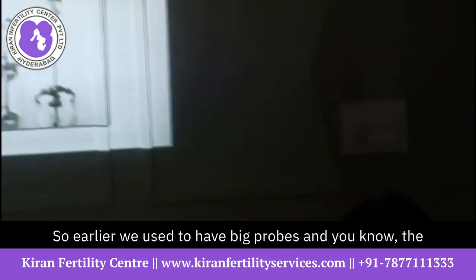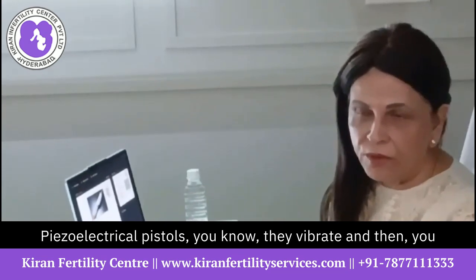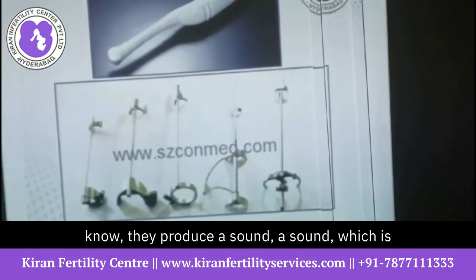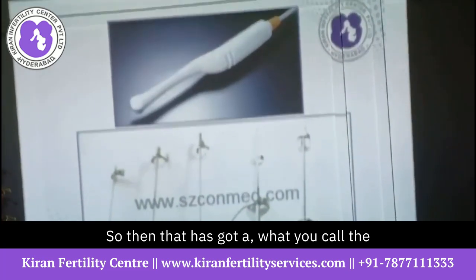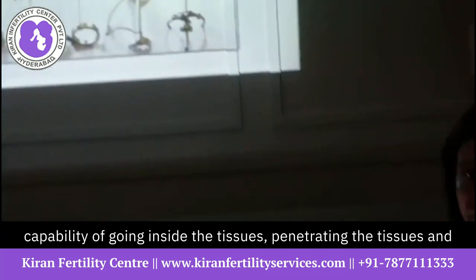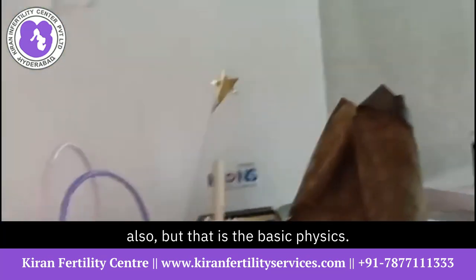Earlier we used to have big probes, with the crystal in the front of the probe. You all know how ultrasound works, no? It is piezoelectric crystals. They vibrate and produce a sound which is ultrasound, which can't be heard by our ears. That has the capability of penetrating the tissues and producing the image for you on the screen. So that is the basic physics. I will tell you more about the physics also, but that is the basic physics.